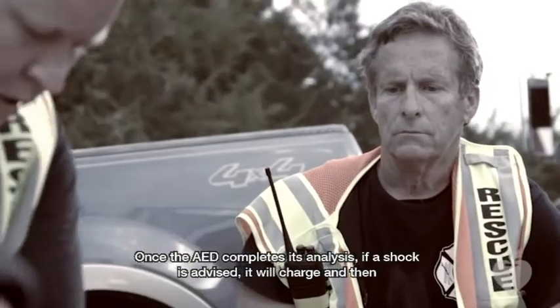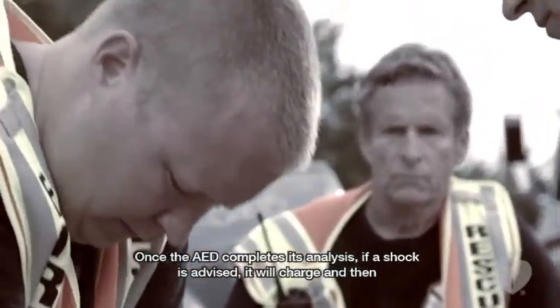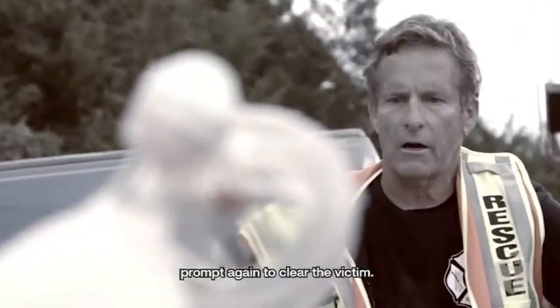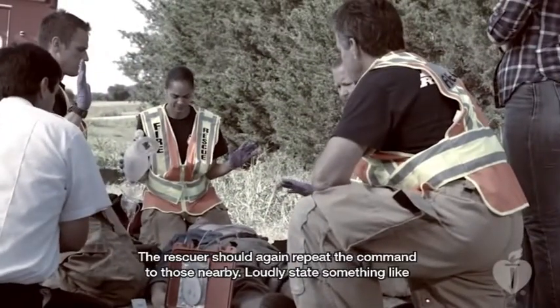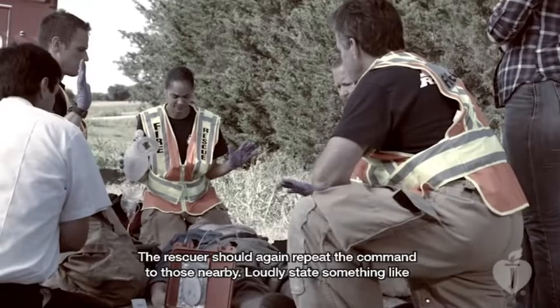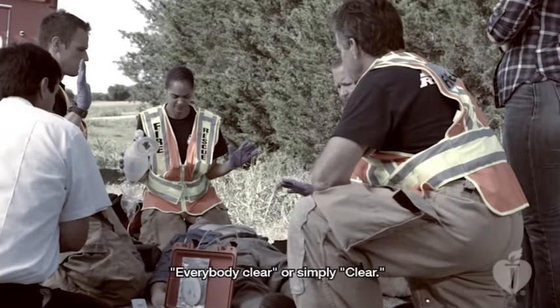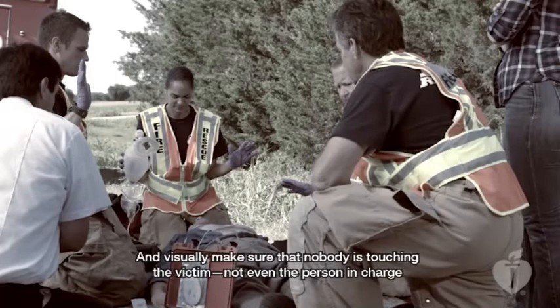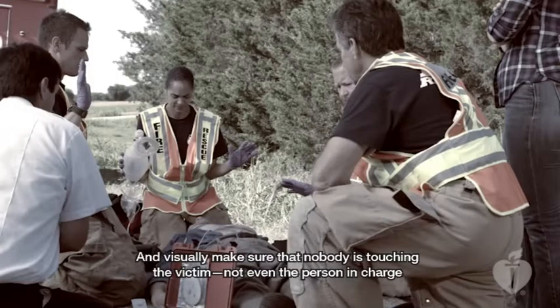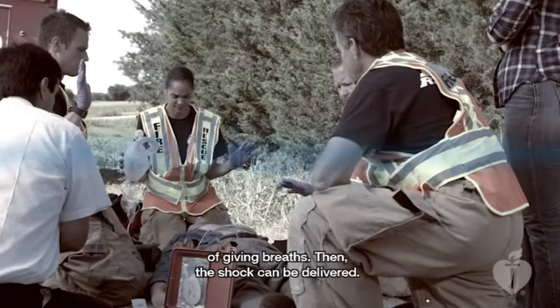Once the AED completes its analysis, if a shock is advised, it will charge and then prompt again to clear the victim. The rescuer should again repeat the command to those nearby. Loudly state something like, 'Everybody clear' or simply 'clear.' And visually make sure that nobody is touching the victim, not even the person in charge of giving breaths.